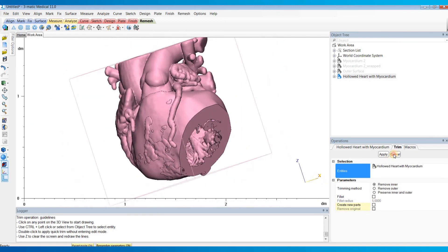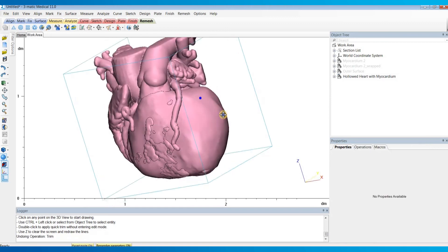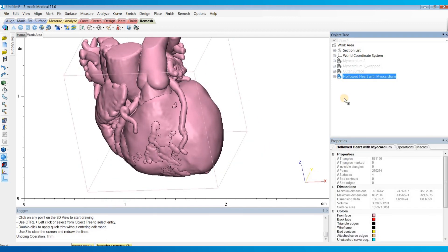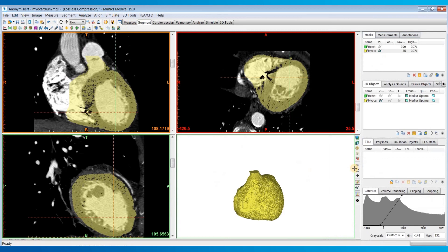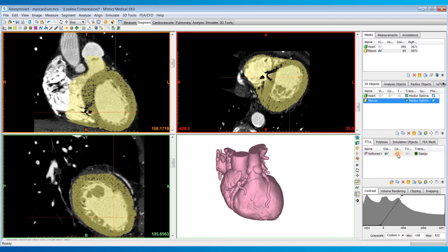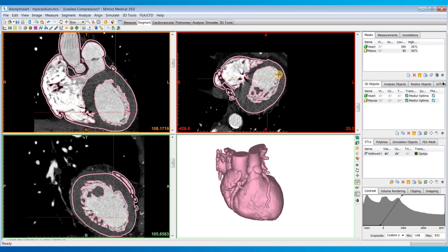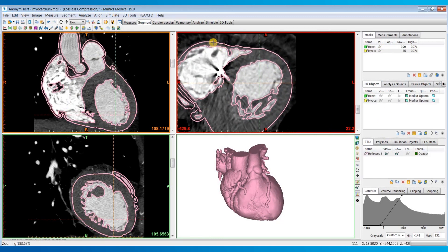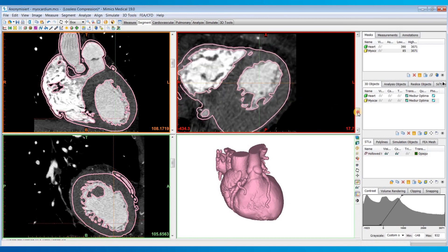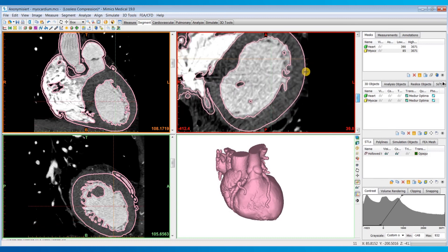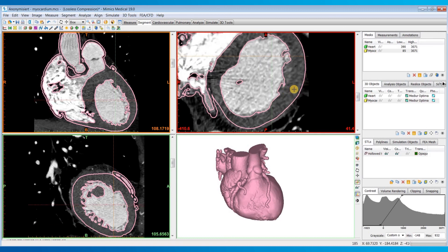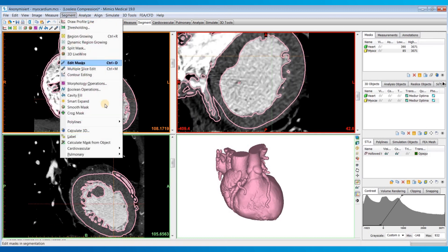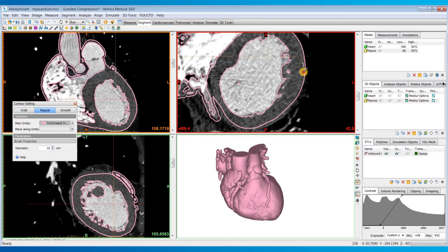I also typically recommend after adding the myocardium to copy paste this part back into Mimics using Ctrl+C, Ctrl+V like we did earlier. Then you can turn on the contour lines and see how the outer contours of this myocardium corresponds with your images. If maybe your segmentation was off slightly, you could use the contour editing tool to manually adjust that outer surface.